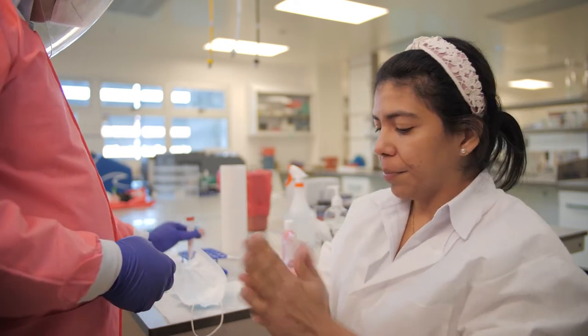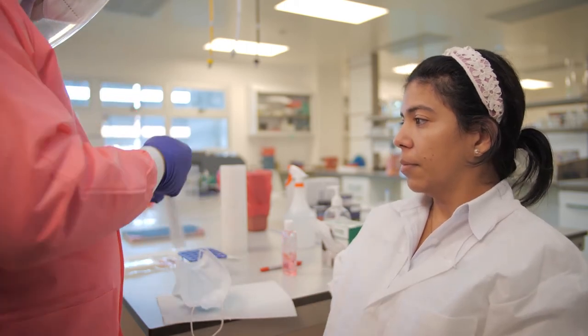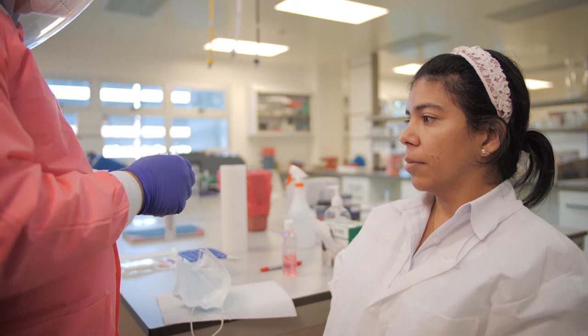Position the patient into a comfortable position and, if possible, have them rest their head against a wall to ensure no movement during the sample collection process.